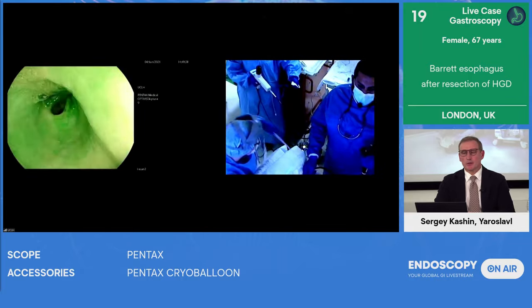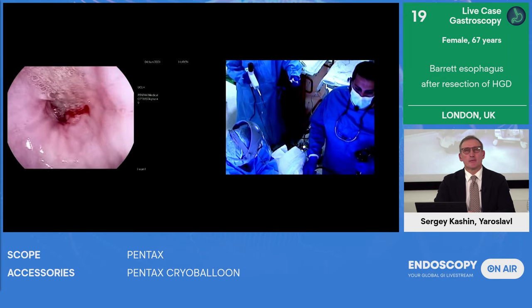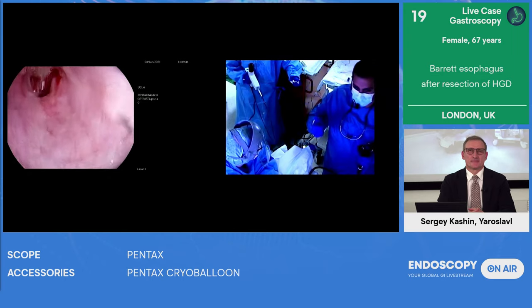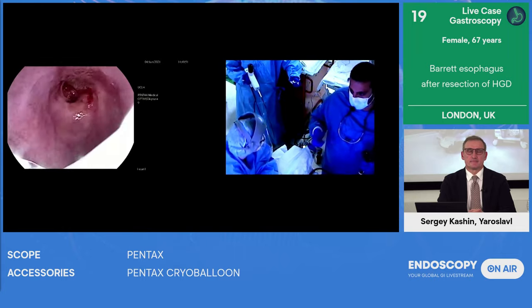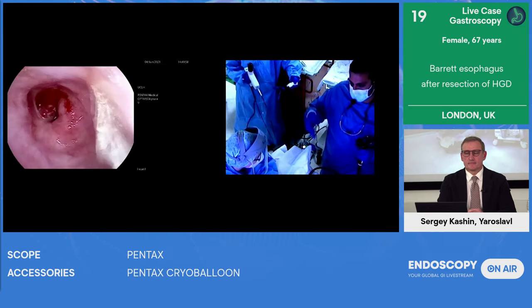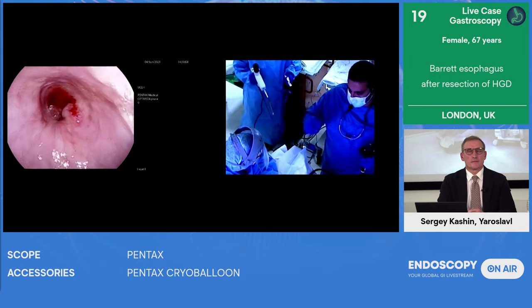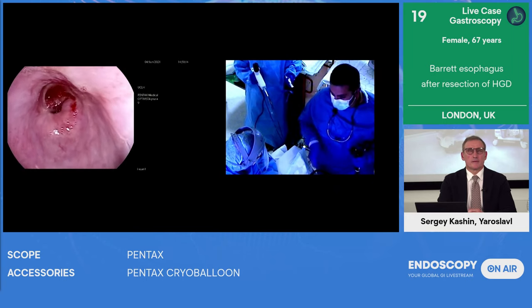And the last question to you: is cryotherapy for Barrett's esophagus a cool alternative to RFA or APC? What do you think? Yeah, I like the word cool alternative. I think at present it has a place in the treatment of refractory neoplasia in Barrett's and in the treatment of patients with difficult anatomy that would be difficult to access with the conventional ablative tools. As a first line alternative to de novo virgin Barrett's, we don't know yet. We don't have that head-to-head data, and so that will be collated prospectively. But certainly in those two indications that I've mentioned to you, it's got a really good role with evidence to back its efficacy. Okay, thank you so much.